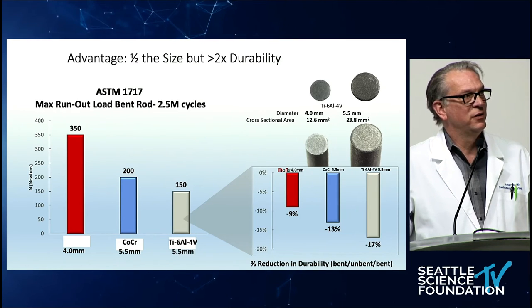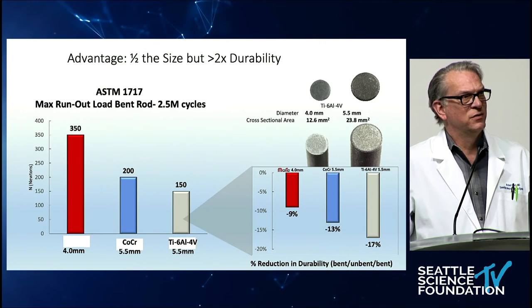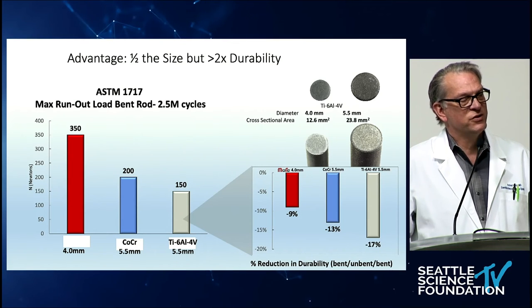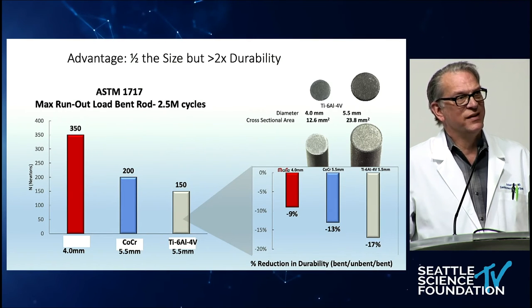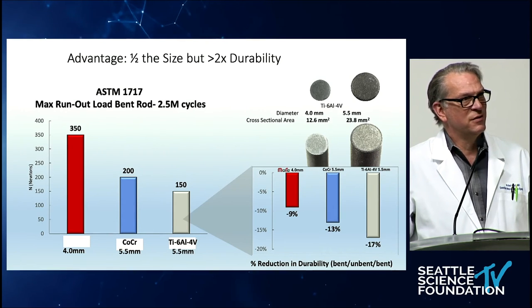And here's yet another example, and not only is it stronger, it's stronger even when it is in smaller diameter, so it makes a nice option for pediatric patients or for very thin patients. The size available is going to include 5.5 diameter rods, and the ability to bend a rod greater than 5.5 diameter is pretty limited, so I think that's probably going to be the largest size available of this device. But I think this is something we're all going to want to use in the deformity community as it becomes available and more widely accepted.